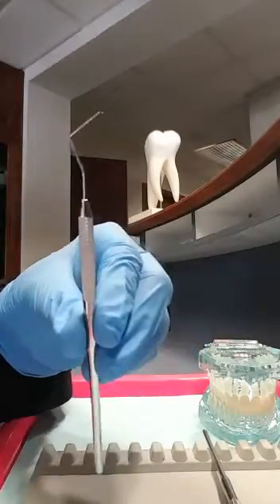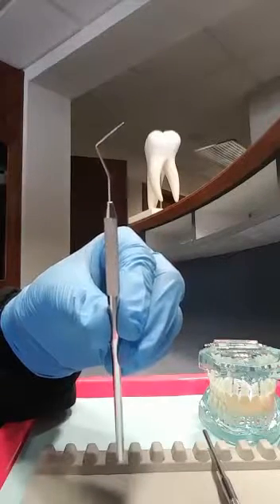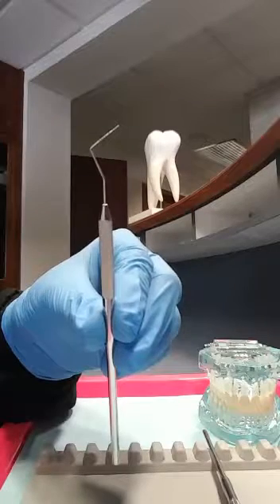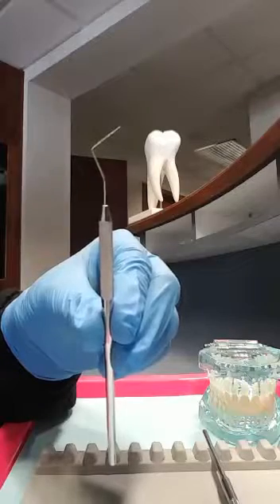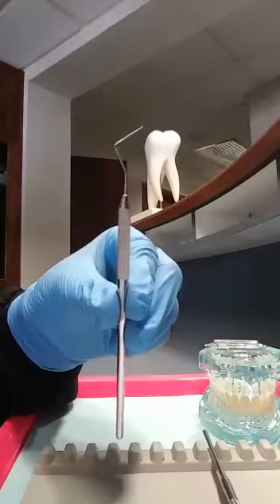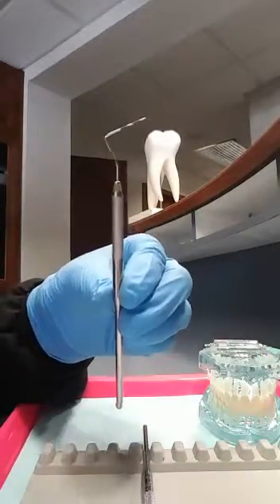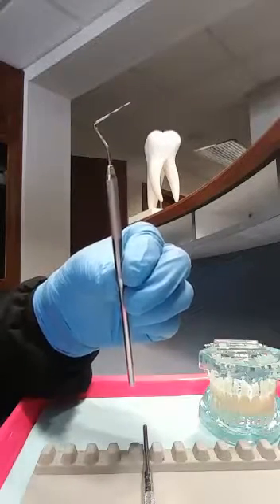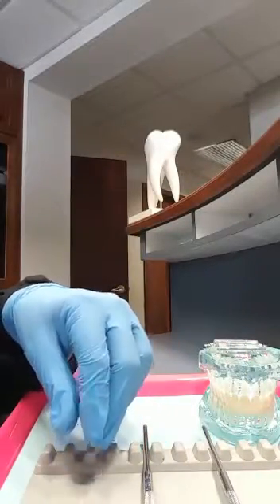The periodontal probe is an examination instrument that is calibrated in millimeters. It measures the depth of the periodontal pockets. Some have millimeter measurements like this one, and other ones are color-coded like this one, to do the measuring around the teeth.